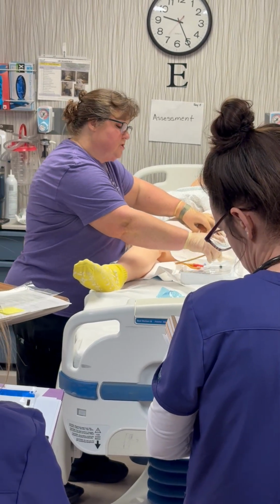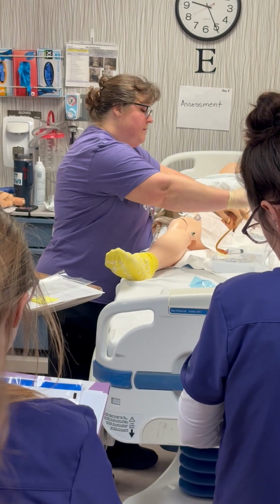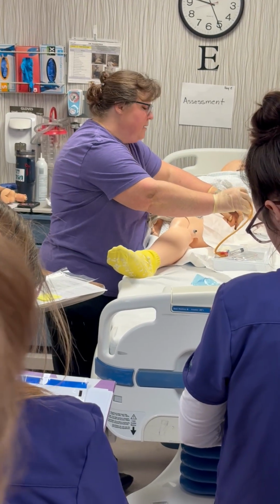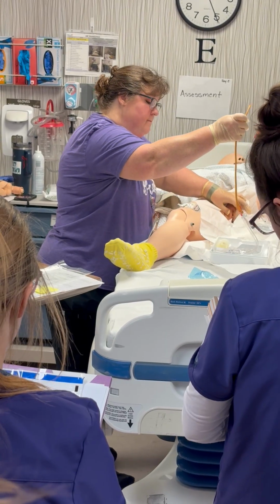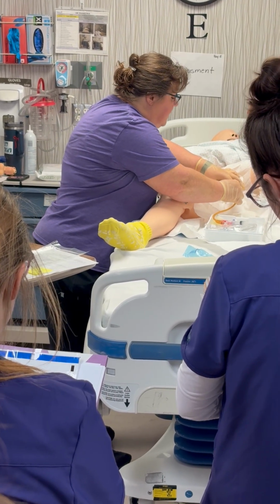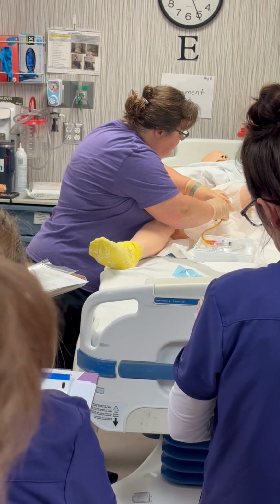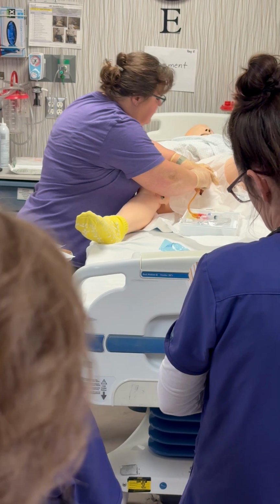Now you're going to insert this Foley catheter, and you're gonna tell her, okay, you might have some discomfort here. Take a nice deep breath and bear down for me, okay? And then I'm gonna insert this. How far? Until you get urine. Until I get urine, okay?